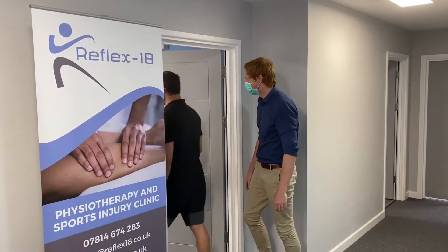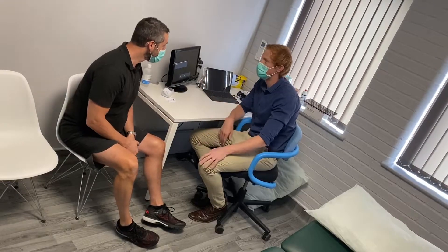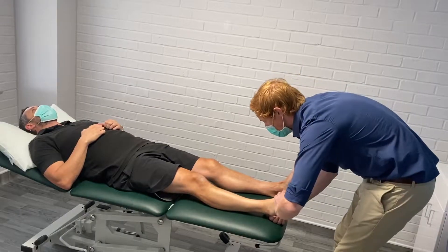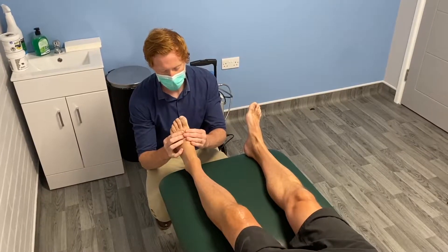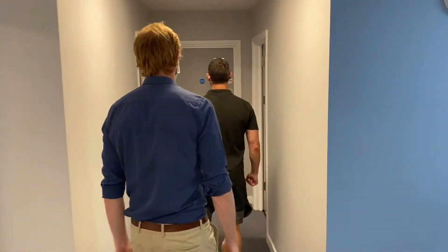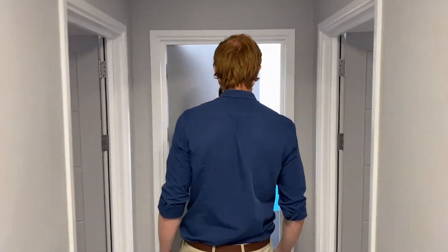When you attend your appointment for a gait analysis with the RS Foot Scan, we will take a full history from you and assess your back, hips and knees to understand how you move and how this may relate to the scan. Once we have understood what you are looking to achieve from the foot scan, we will move on to the analysis itself.